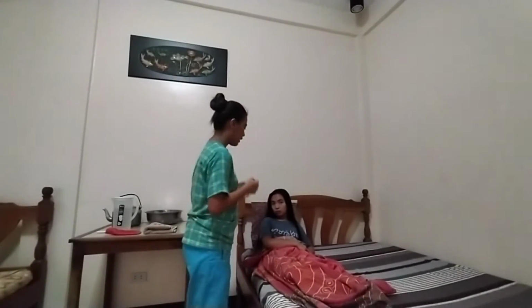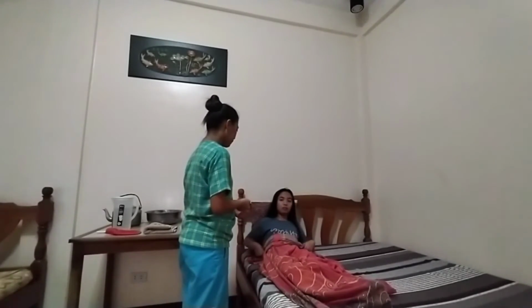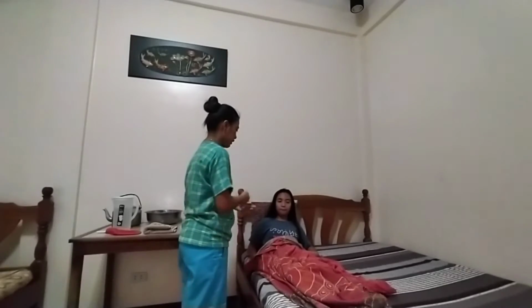Apply talcum powder locally. So the equipment is hot water bag, bath thermometer, linen cover, and pitcher of hot water. So, ma'am, again, I'm Armin Pipaktanak. Now, I'm going to apply the hot water bag. Okay lang po ba? And may I know your name? My name is Ryan. Your age? Okay, ma'am. Thank you. And relax ka lang po.